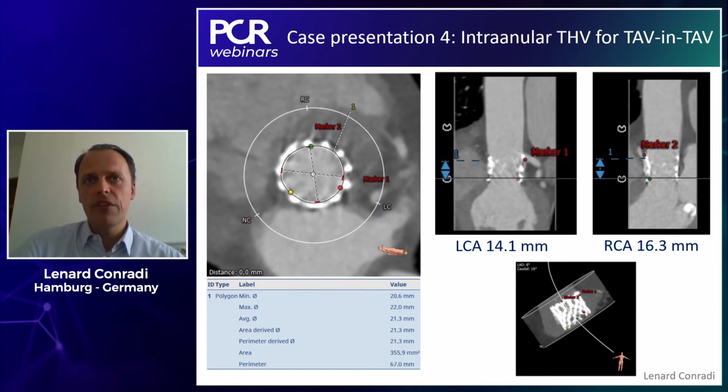And in the hockey puck view on the bottom right, one might even have the suspicion that this 26 valve is not completely expanded. So there must have been some really heavy oversizing that the implanters back then chose. So typically, I think for most of us, valve-in-valve procedures are done with supraannular valve designs. But here in this particular case, we were quite hesitant because of those close spatial relationships.